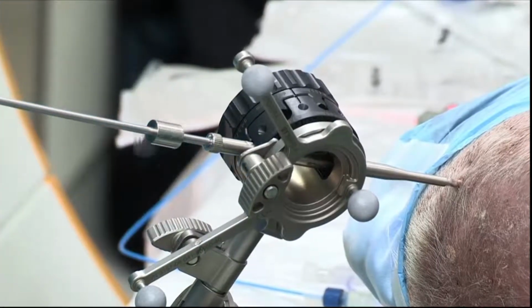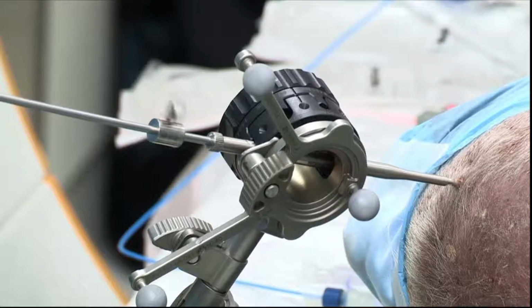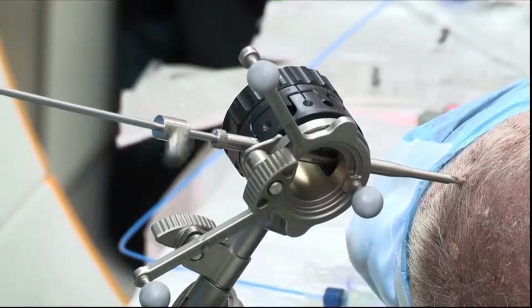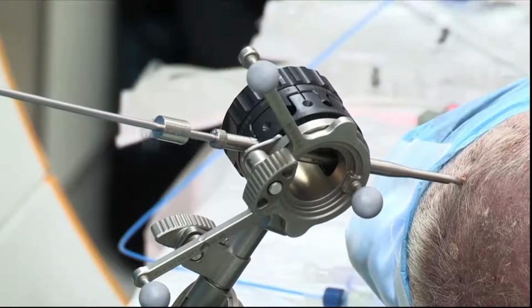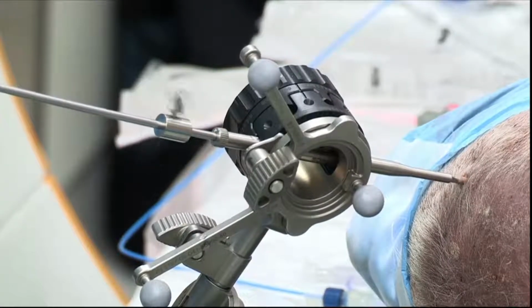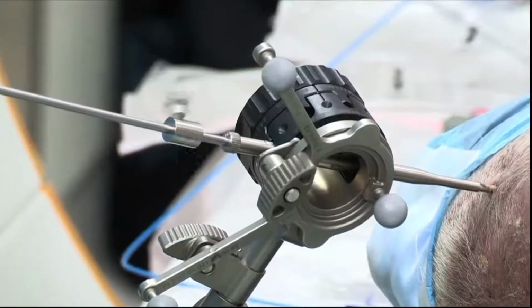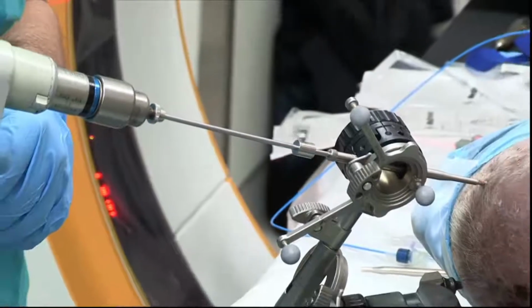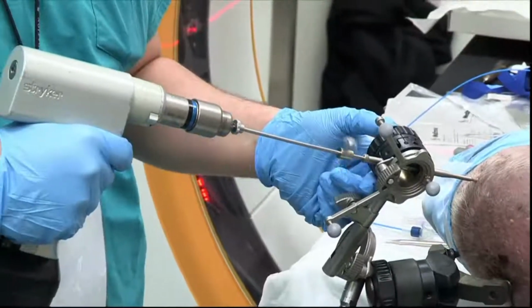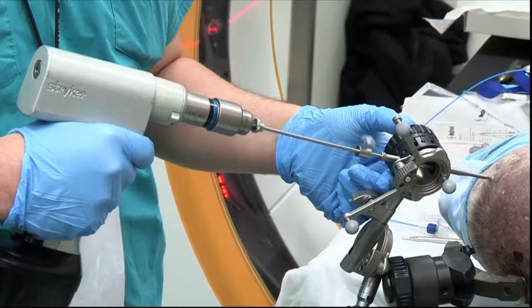And you want to make sure you don't drop your hand. I have a tendency initially using this to drop my hand, and that will, if the drill, it's a very snug fit, so you can actually fuse the drill within the cannula. And you kind of push and wait and make sure there's bone there. Kind of make sure there's still bone.